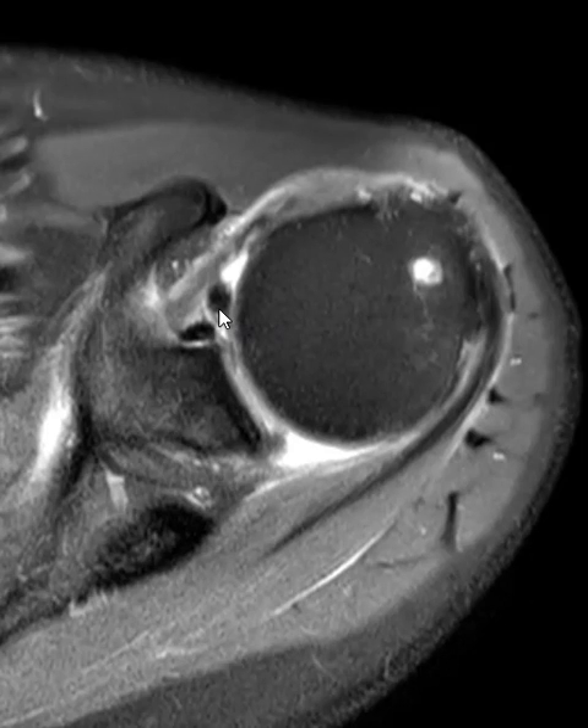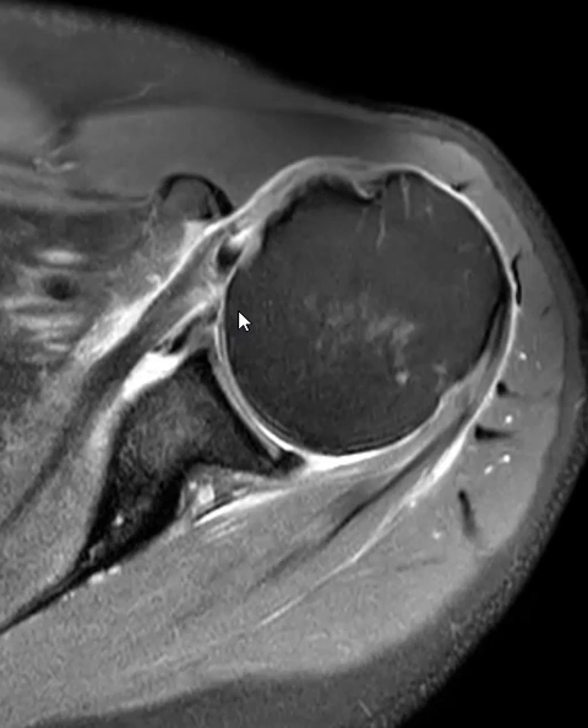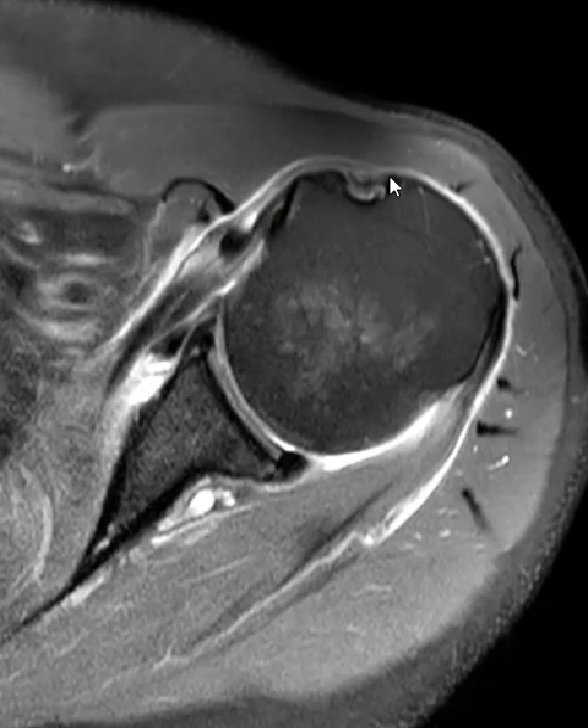Now, in this axial view, we can see the biceps tendon attaching up high, originating from the biceps-labral anchor, and we're going to follow it down. This is the lesser tuberosity where the subscapularis footprint would be, but instead it's torn. There's a transverse ligament component that goes over the top of the bicipital groove here, and when that tears, the biceps tendon can slip medially — a lot of times going between the fibers of the subscapularis tendon.